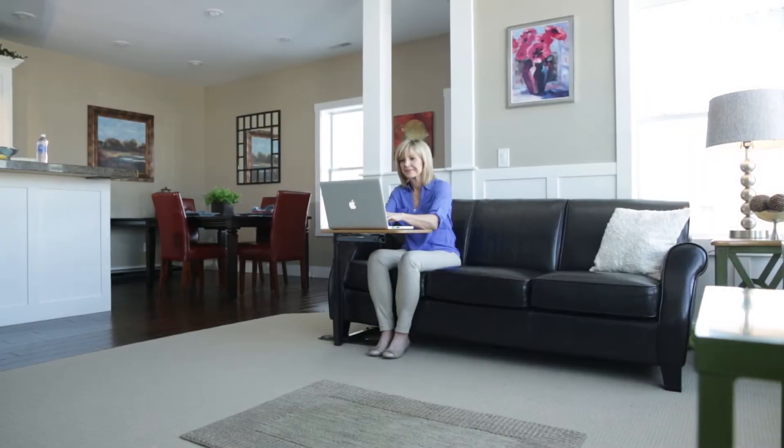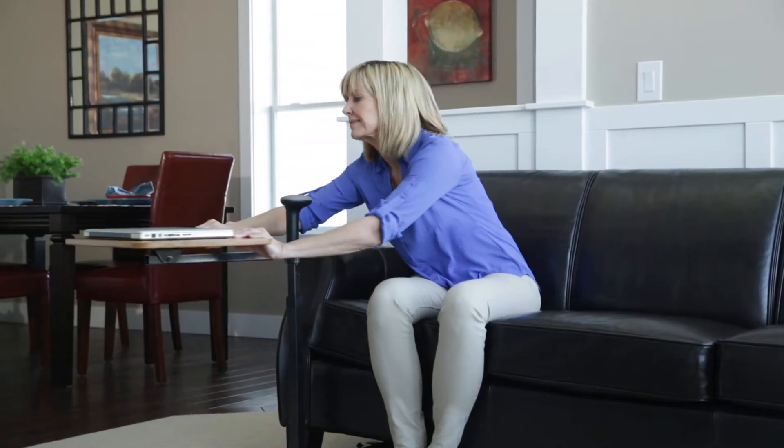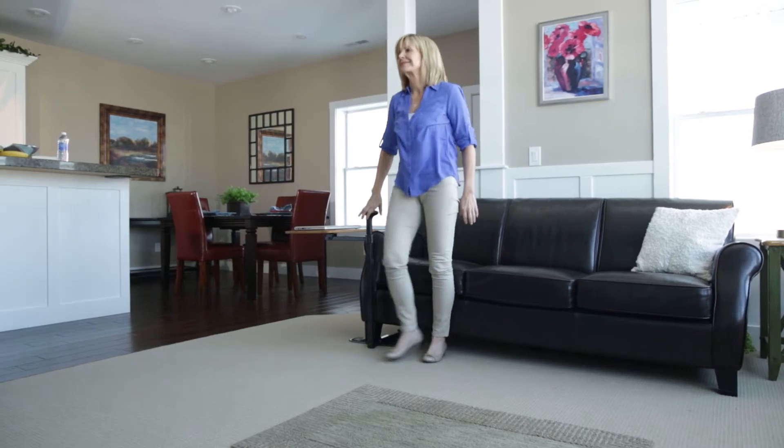Whether you like to surf the web, enjoy a meal, or simply need a little extra support while standing, the Omni Tray from Stander will give you the support you need and the convenience you deserve.